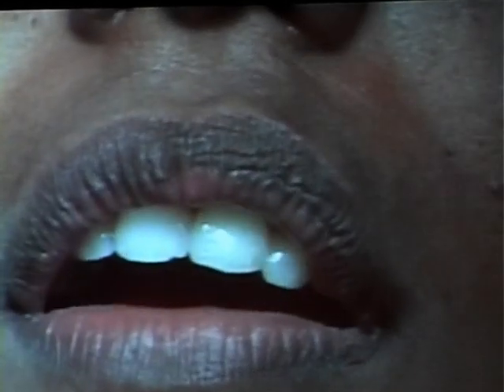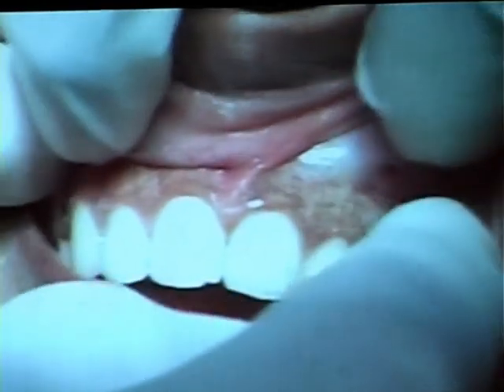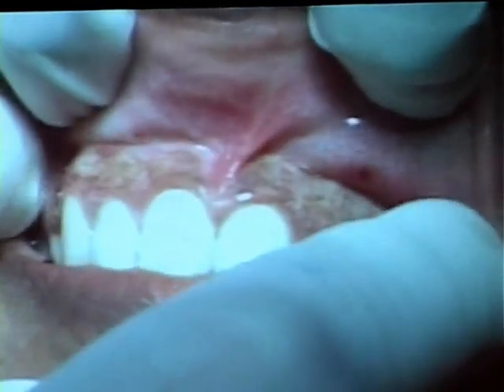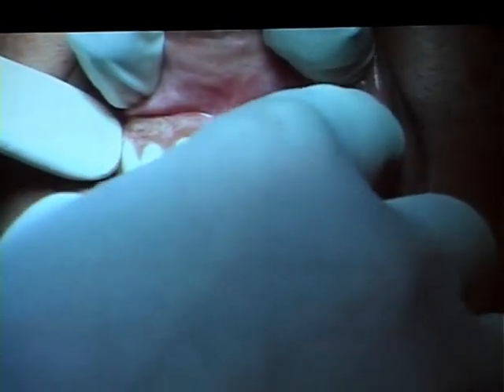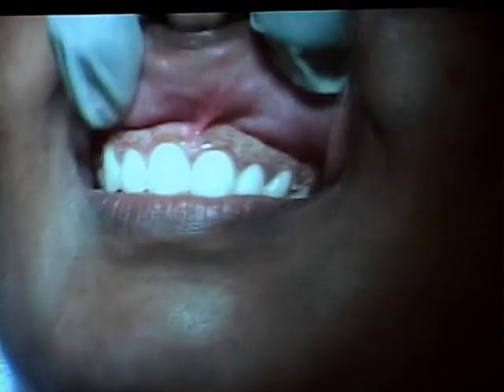If you want smooth skin, then you resurface it with an erbium laser. But if you have a more melanin pigmentation lesion, you can use a Nd:YAG. So if you compare it, in general, there is no difference in result. Yeah, there will be. We don't expect that. Thank you very much. Very good.